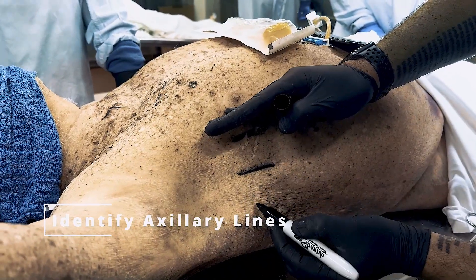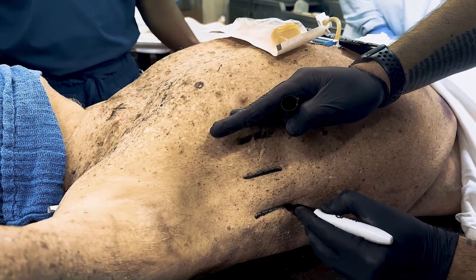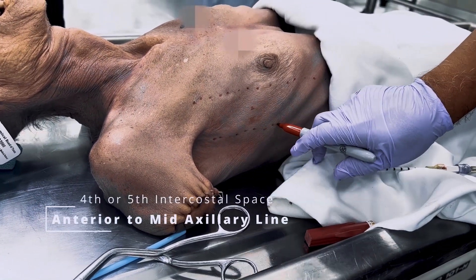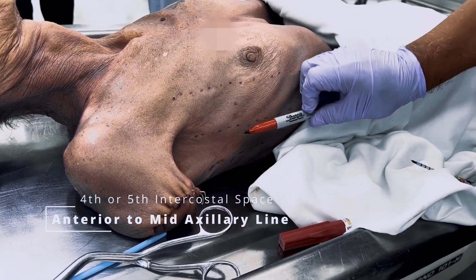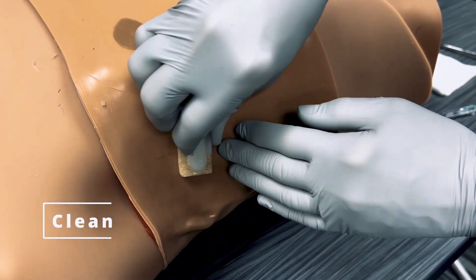Raise the patient's arm above the head and locate the incision site. Identify and mark the landmarks at the 4th or 5th intercostal space anterior to the mid-axillary line. Cleanse the site with chlorhexidine.